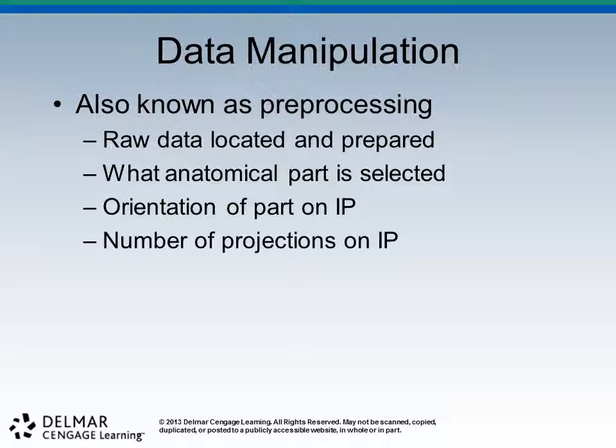This we're getting away from. We did that on film all the time. We would do 2, sometimes 3 radiographs on the same cassette. It seems to be much better if we just do one image per image plate. Things seem to be better for the computer because the computer, I've said this 100 times to y'all, only knows what you tell it, and it's not very bright because it really only understands on or off.